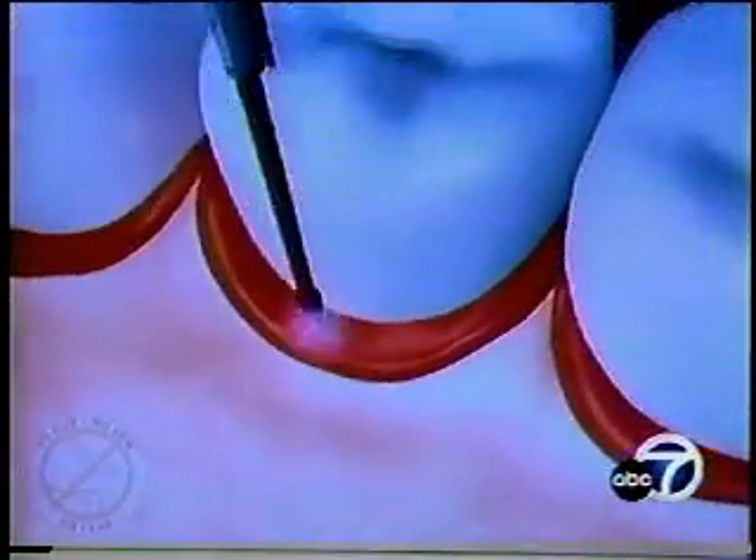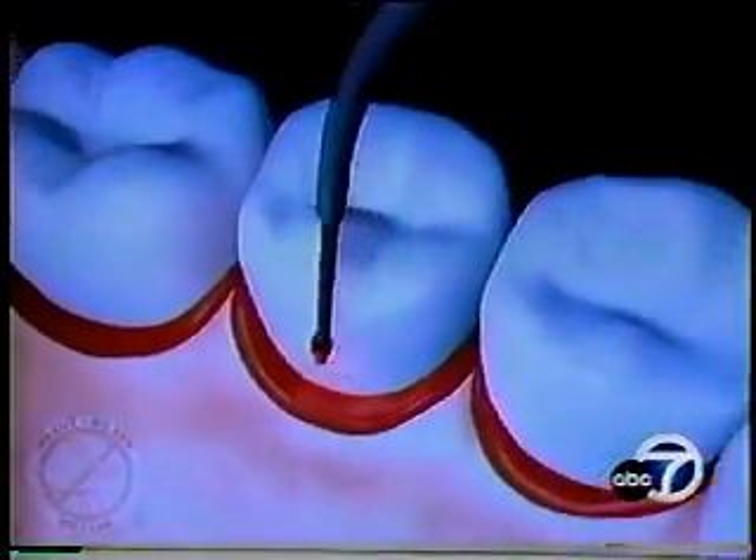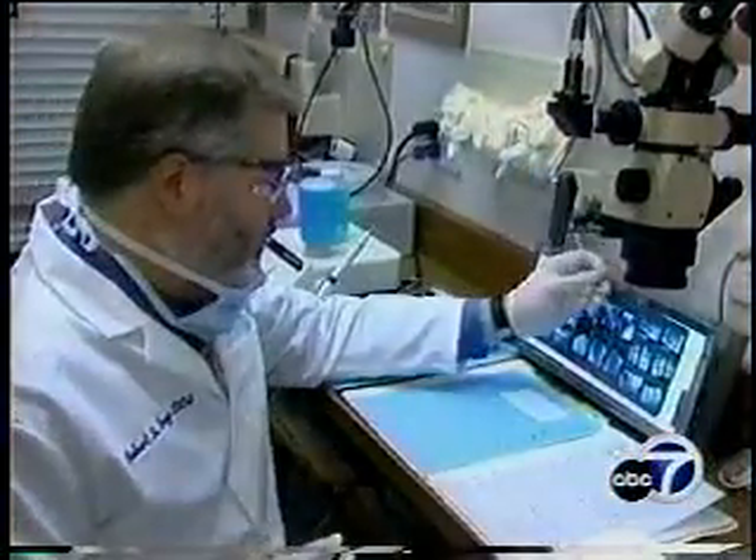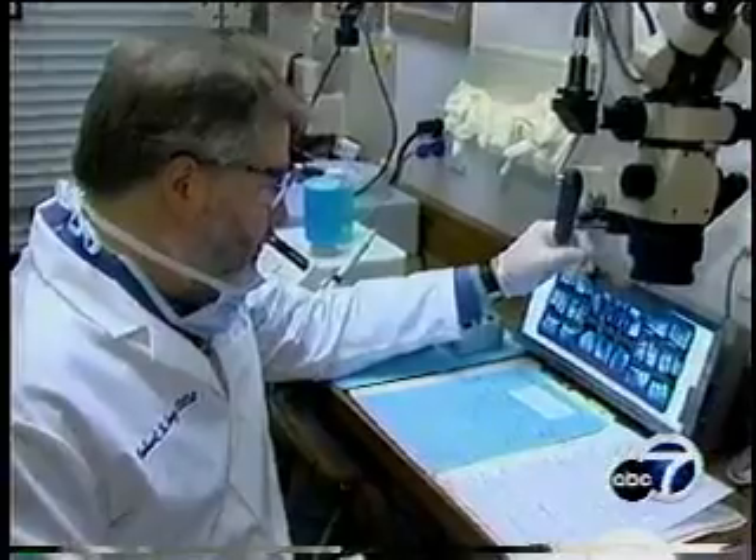One of the nice things about this technique is we're only treating the patient once. For most patients, the laser treatment also means fewer follow-up visits and less time in the dentist's chair.